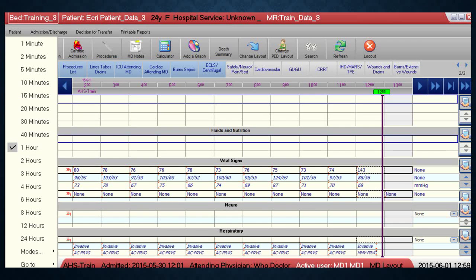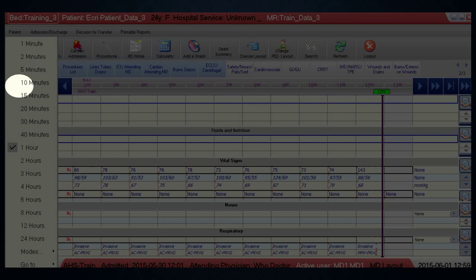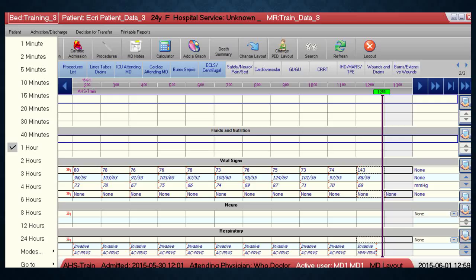The chart columns are in hourly increments by default, but you can change this for more fine-grained information. Data flowing from ventilators and monitors is captured every minute, but shown once an hour to give a 12-hour shift-based overview. If you want to change the time resolution, select the clock button, which brings up a drop-down menu to select whatever increments you'd like. This is particularly helpful when viewing patient data in graph format.